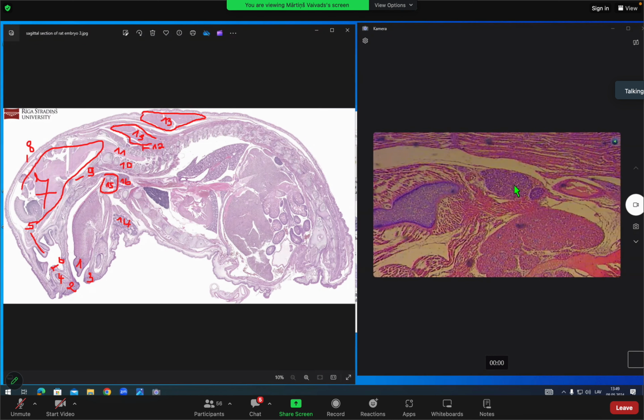So far, so good. Be careful. You might see brown adipose tissue also in the neck. It's not in the slide picture, but you can easily spot it here. Next to the thyroid gland, even some brown adipose tissue can appear.